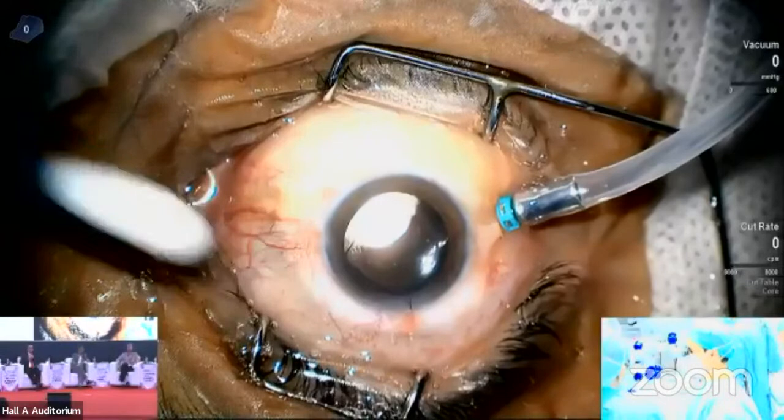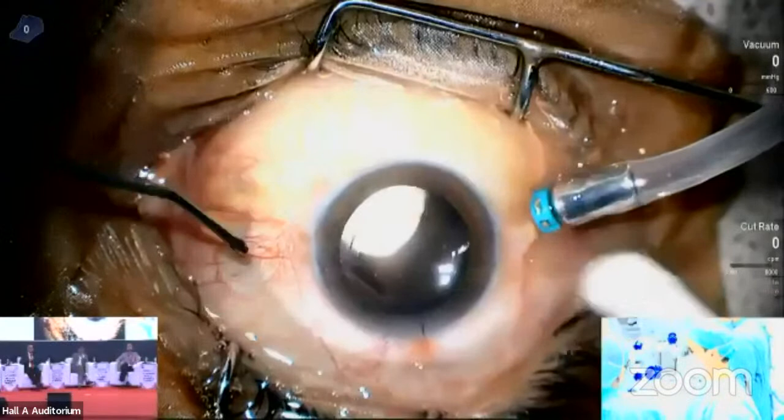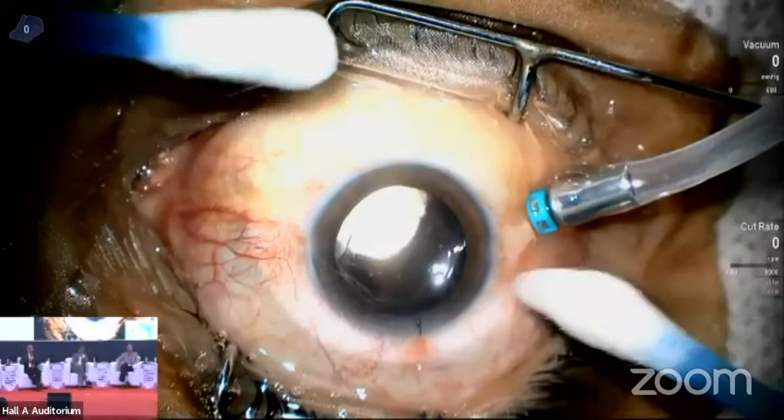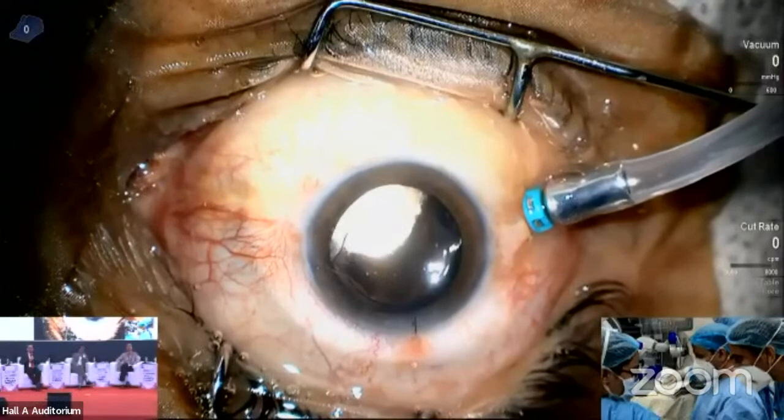So had this been 23G, would you have closed the ports a little differently? Sir, we have a very low threshold for putting sutures. If we feel that it is not closing with massage, we go ahead and put sutures. But with 25 gauge, you just have to be a little more patient, and the ports usually will close once you give them massage. Just a little bit. Inject.